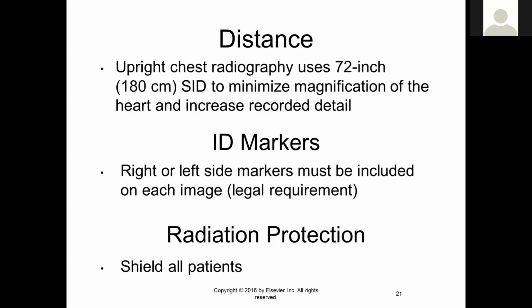Radiation protection, we're going to shield all patients. Most facilities have a movable shield that's on wheels that can just be rolled behind your patient, or clip-on lead shields that hang on the waist, just belt around the patient.